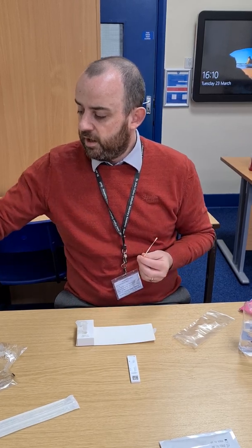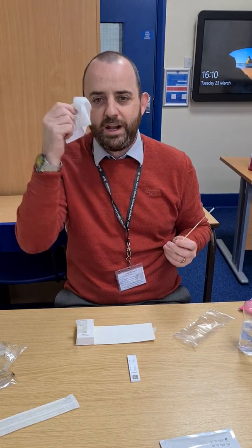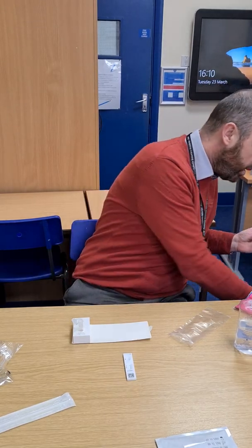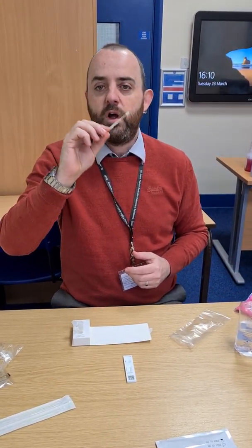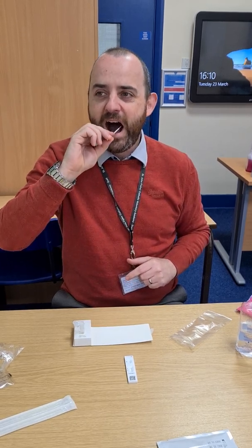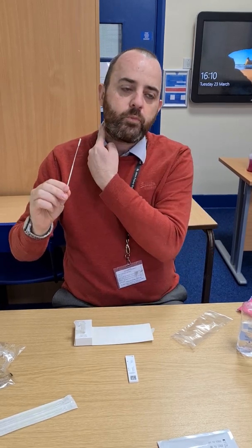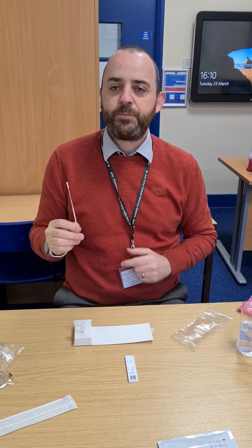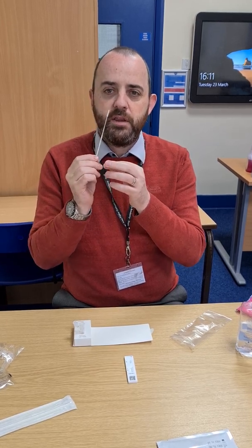Just before completing the test, it's useful to clear your nose so you have a clear area to take the swab — a brief blow of the nose. First, four swabs on one side of your throat with an up-and-down action, then four on the other side. Then take the swab, place it up one nostril until you feel a tiny bit of pressure, and spin it ten times.